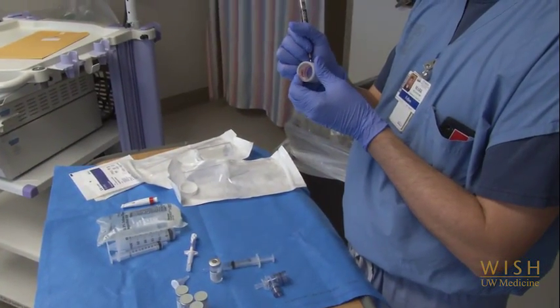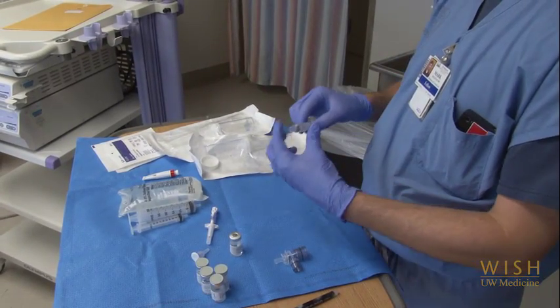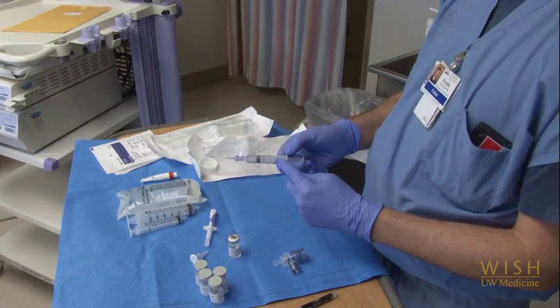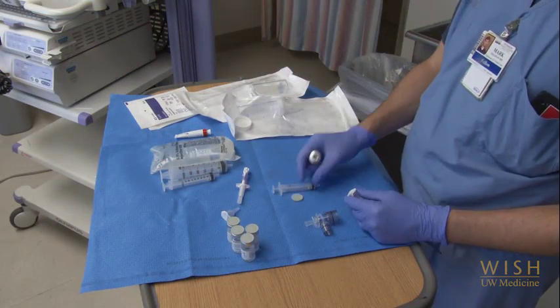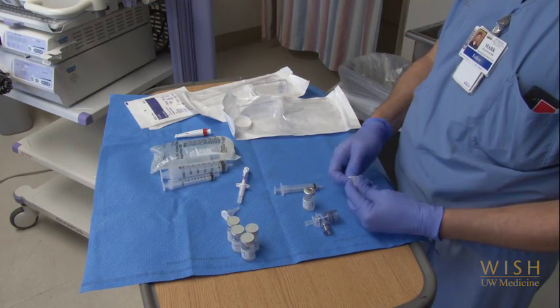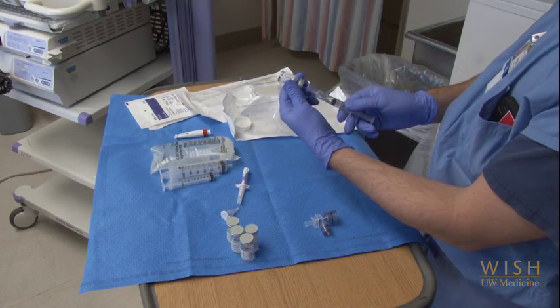Before you start the procedure, you want to get your first bolus of lidocaine ready. Lidocaine most often comes in small vials of 2% solution. Label and fill at least two syringes with 1 cc of lidocaine and several cc's of air to flush the bolus of liquid through the scope. Having more than one syringe ready at a time will allow you to move faster during the procedure.